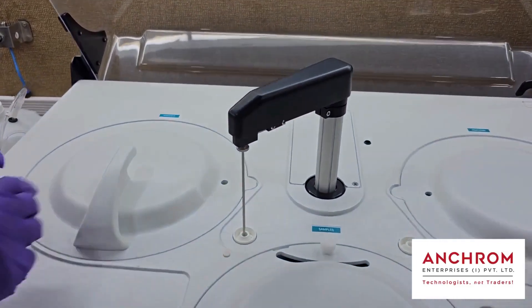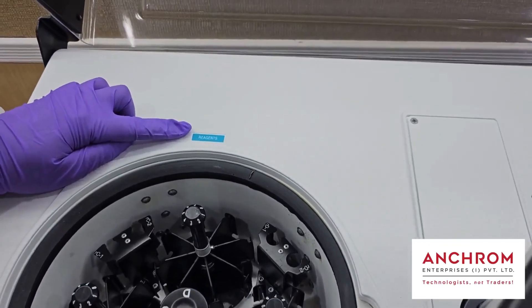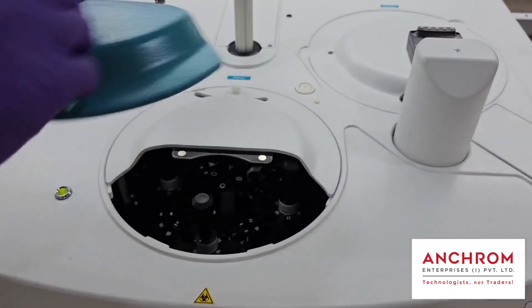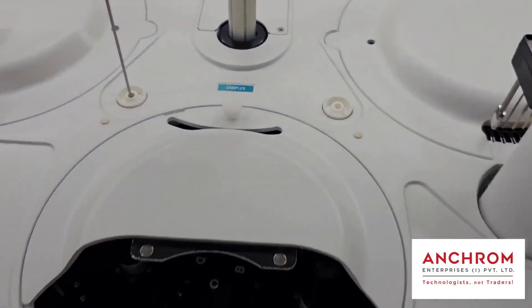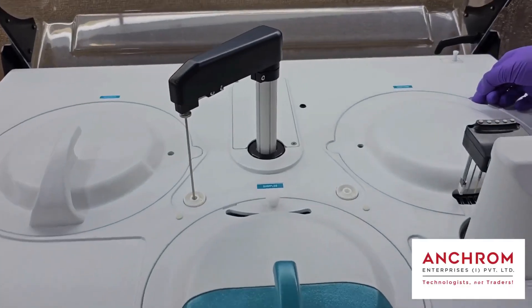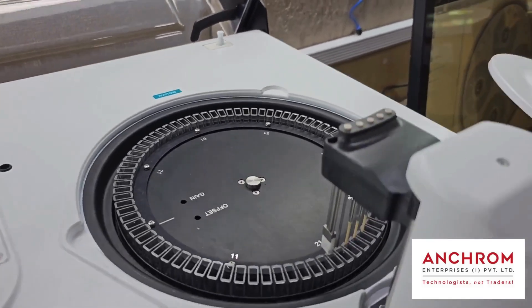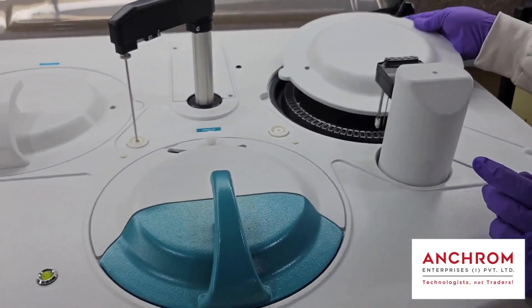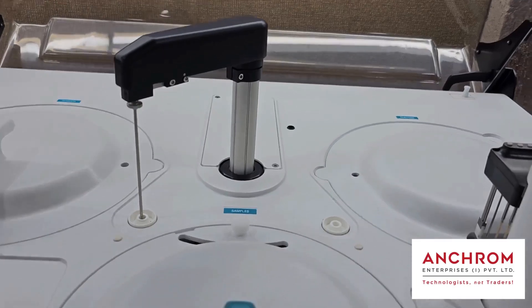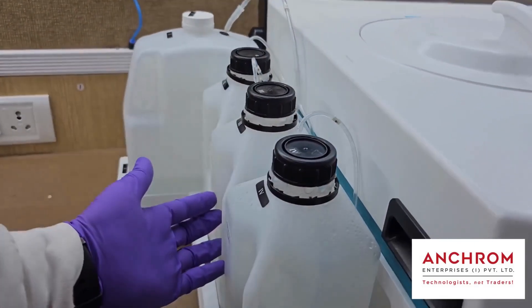SmartChem 450 is divided into three parts. The first part is the Reagent Chamber, the second part is the Sample Chamber, and the third part is the Reaction Chamber. This Robotic Arm is used to perform sample and reagent reactions, and here are the cleaning and rinsing bottles.